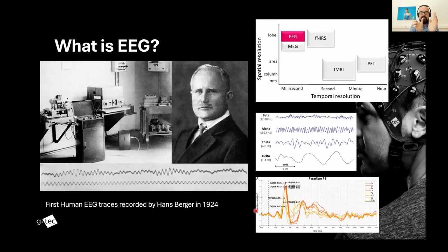And these traces are usually used, for example, in BCIs, where we've seen the Unicorn being able to discern, for example, faces versus other images, or selecting items for video games. So you can use these kinds of paradigms to be able to discern different kinds of brain activity and what kind of activities the person is performing while wearing an EEG cap.